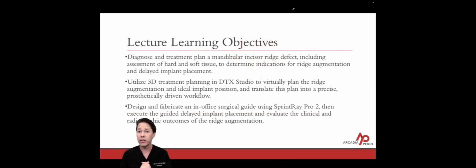There are three learning objectives I want you to understand and take away from today's presentation. Number one, I want you to be able to diagnose and treatment plan a mandibular incisor ridge defect, including the assessment of hard and soft tissue, and determine the indications needed for ridge augmentation and delayed implant placement. I want you to utilize 3D treatment planning using DTX Studio to virtually plan the ridge augmentation and the ideal implant positioning and translate this into a precise prosthetically driven treatment plan.